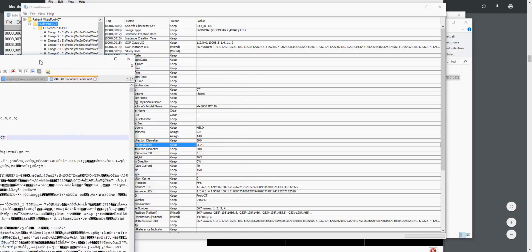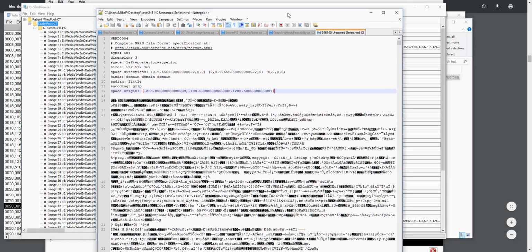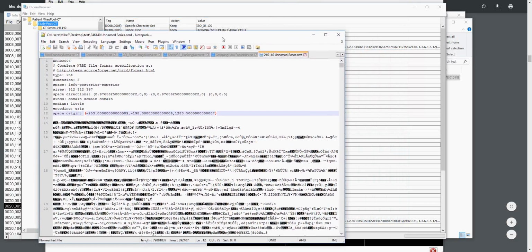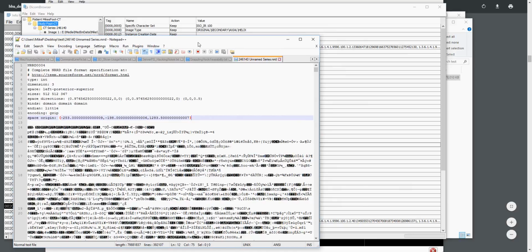So anyways, that is a basic overview of Dicom data. There's a whole lot more, but for the purposes of creating models and loading data in, this should cover most of what you need and hopefully give you the tools to find anything else out that you need.